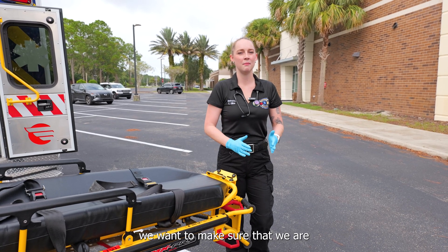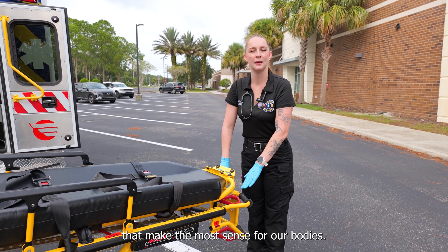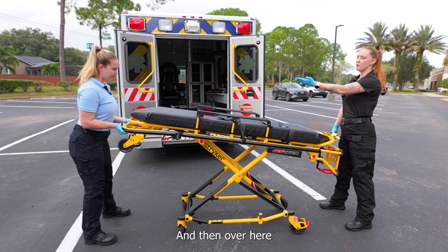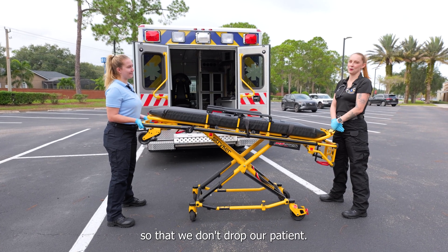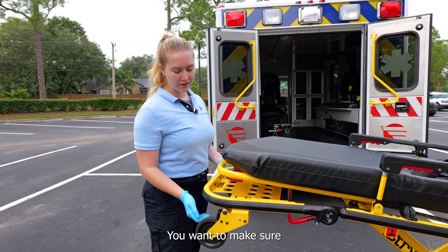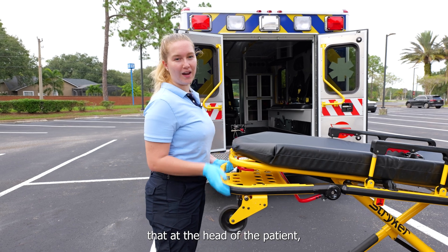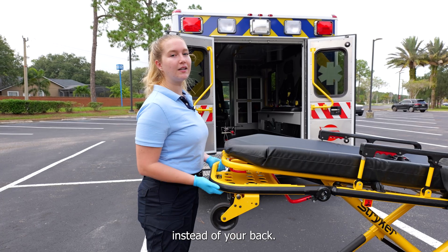When moving the patient up and down, we want to make sure that we are in the proper squat position and holding the parts of the stretcher that make the most sense for our bodies. I'm going to use the top lever due to my height when bringing the patient down. The person at the head of the patient is going to grab these bars right here. You want to make sure you're not holding on to the safety bar at the bottom, as that's not the most practical way to do it. At the head of the patient you will have a little more weight, so make sure you're using your legs to lift instead of your back.